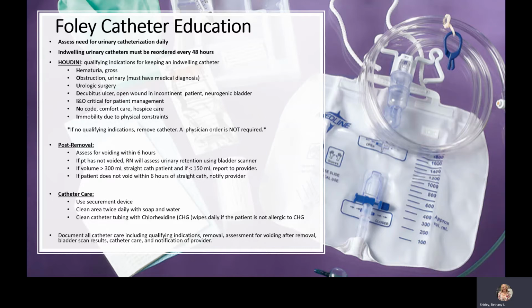If there is less than 150 milliliters seen on the bladder scanner, then that needs to be reported to the provider. If the patient does not void within 6 hours of the straight cath, then that also needs to be notified to the provider.